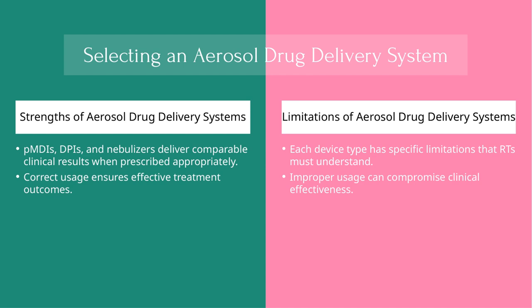Finally, selecting the right aerosol drug delivery system isn't just about availability. It's about matching the device to the patient's needs, their ability to use it correctly, and the clinical situation. A thoughtful approach ensures we maximize the benefits of therapy and improve patient outcomes. Remember, effective treatment hinges on understanding both the strengths and limitations of each system.